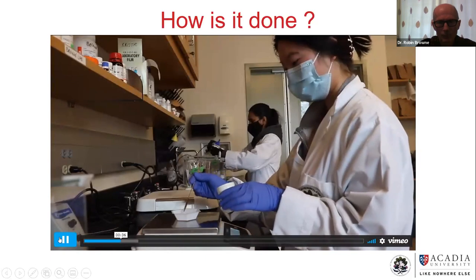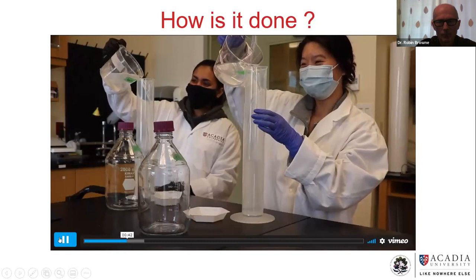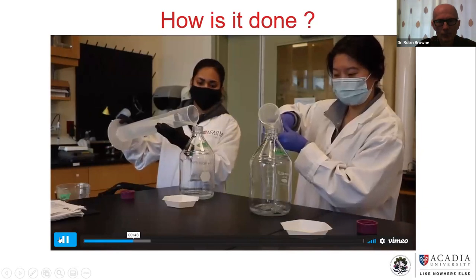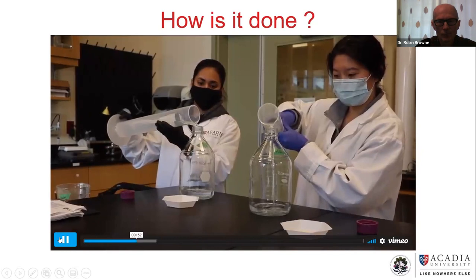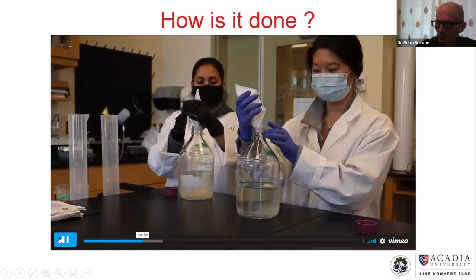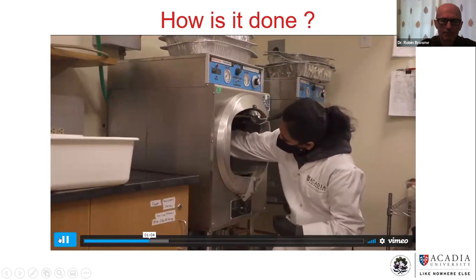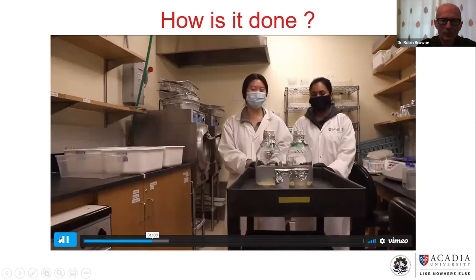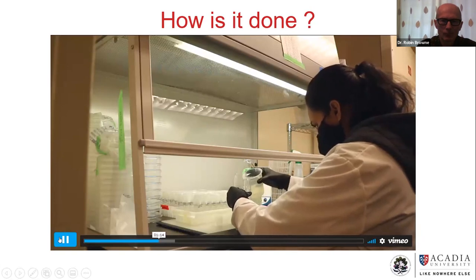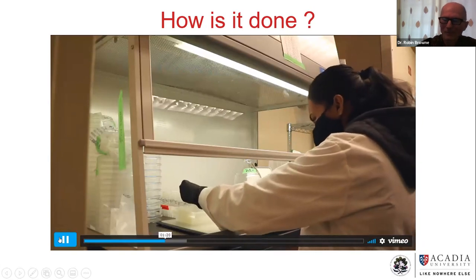An essential requirement for tissue culture is to have defined nutrient media available to establish and maintain cultures, as well as usually to induce regeneration from isolated cells, tissues, or organs. The nutrient media components will vary, but the general preparation steps are similar. The various components are weighed, mixed, and dissolved. Then the pH is adjusted. The media solutions are sterilized, most commonly with an autoclave, which heats the solutions under pressure to kill any potentially contaminating microbes. The media is then removed from the autoclave and taken to a clean air bench for pouring under aseptic conditions, then left to solidify.